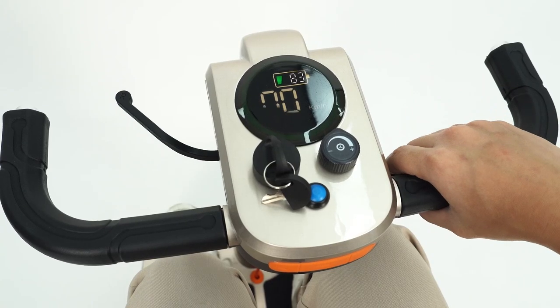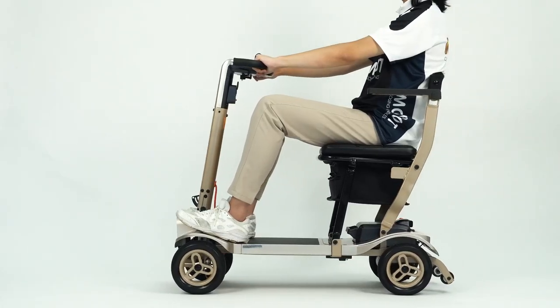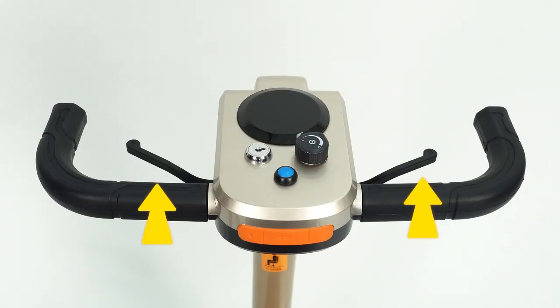Brakes: Once the lever has been released, the device will automatically stop. To move the device, press down on either of the levers as shown before.